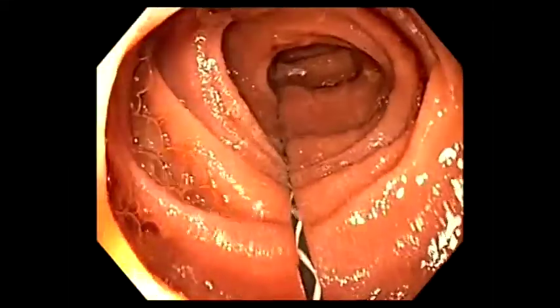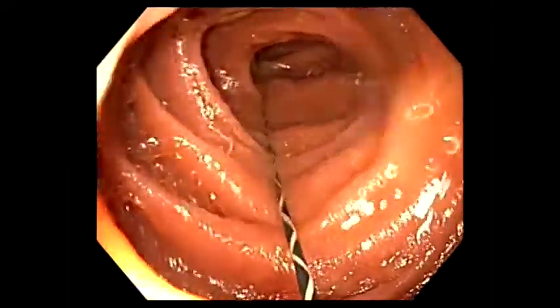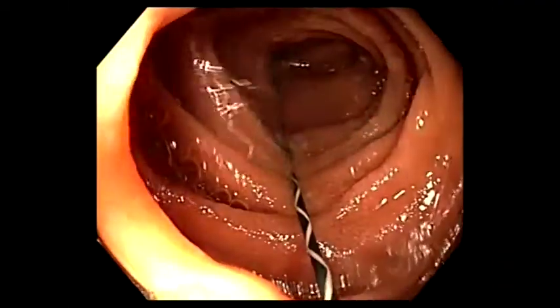Via a guide wire, a balloon dilation catheter was introduced and the gastroscope was removed.